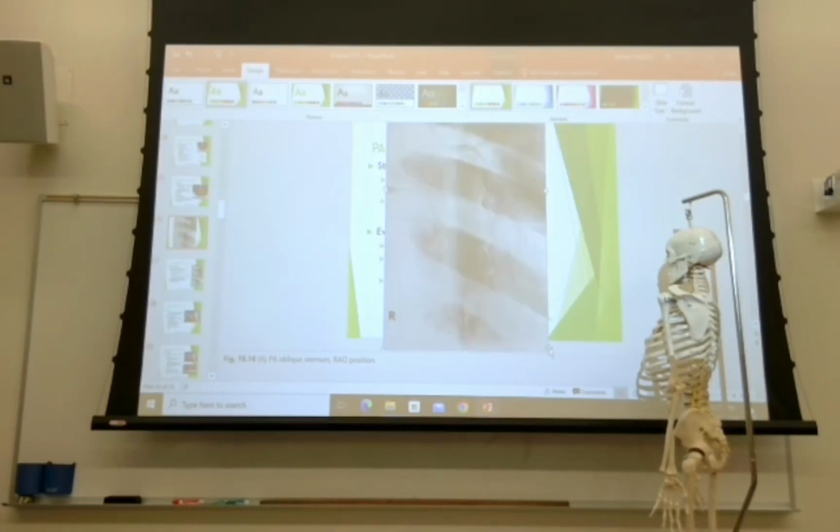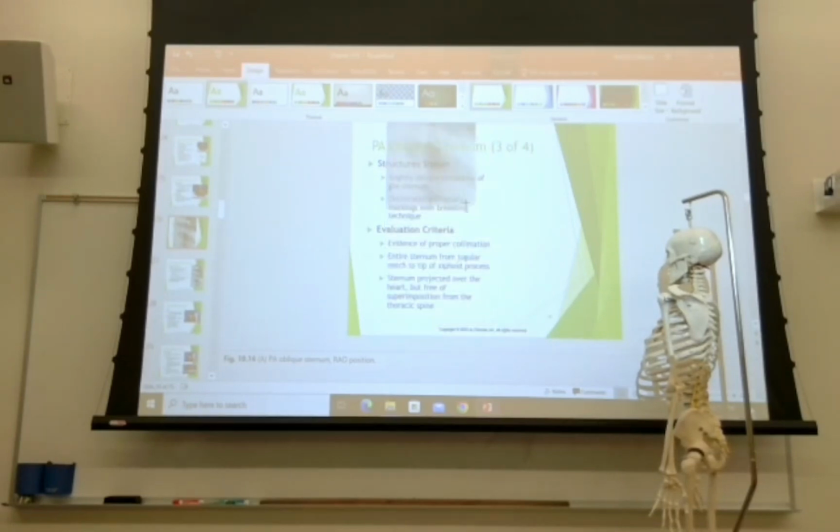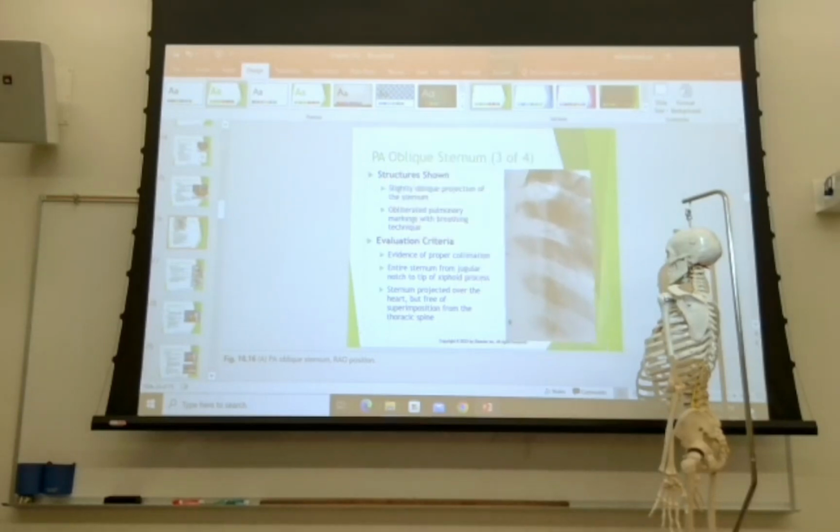Be aware that this is a very tough image to get well on the first try. So even a lot of your seasoned technologists are going to struggle with this. So you as a student, you're going to have a hard time with this as well. Also, you're likely not going to completely comp out on sternums without doing some sort of simulation. Chances of you seeing 3 separate sternums really pretty slim.